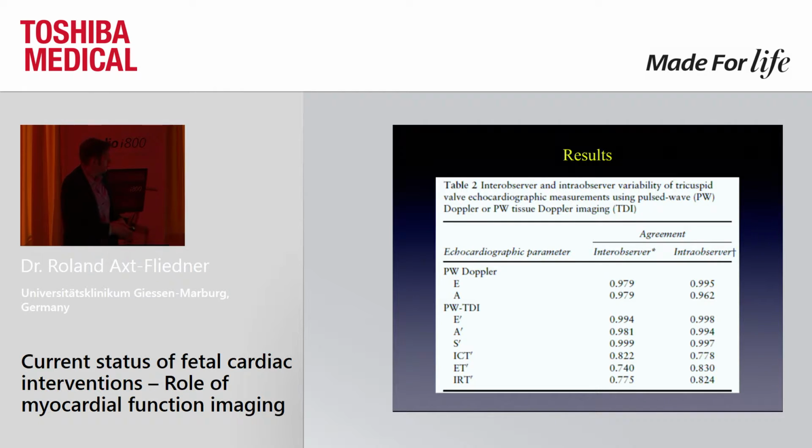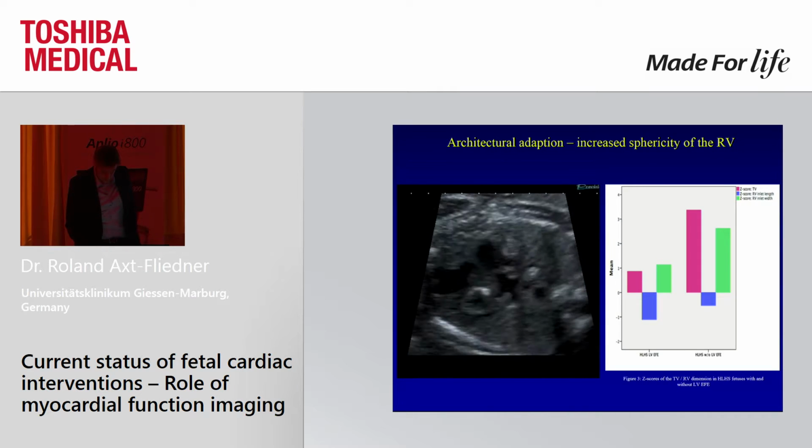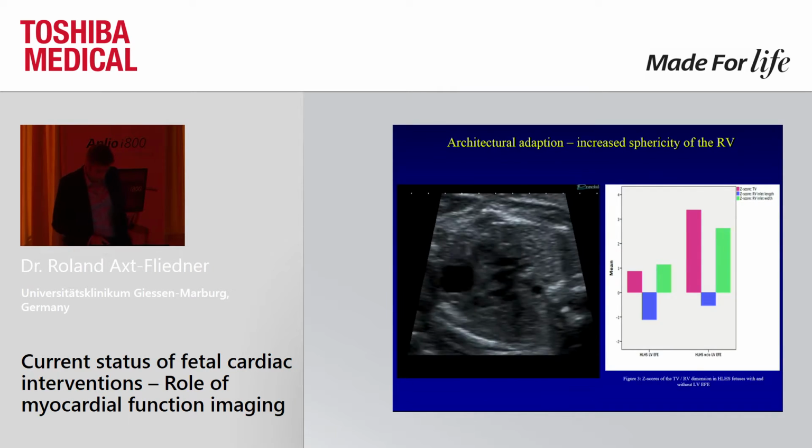We then also, and this is also very important, always look at the inter- and intra-observer variability, and we saw that this is a reasonable result for this very advanced technique, which is really, one has to say, operator dependent, and you have to get involved in the techniques very deeply.